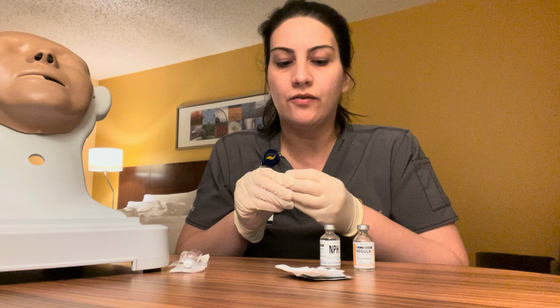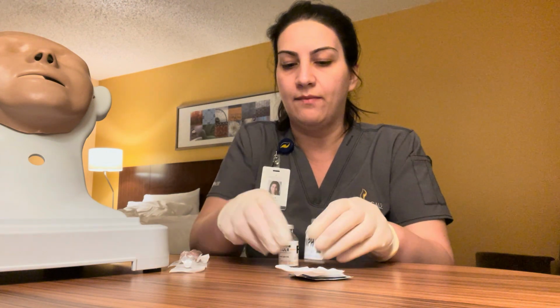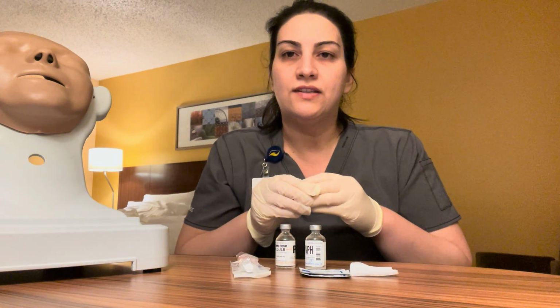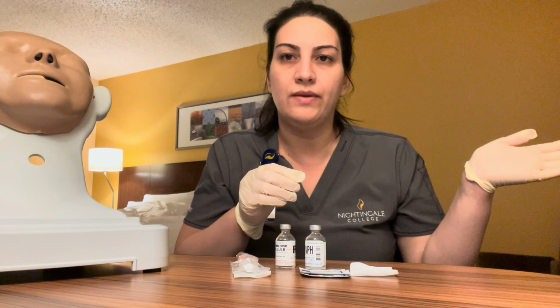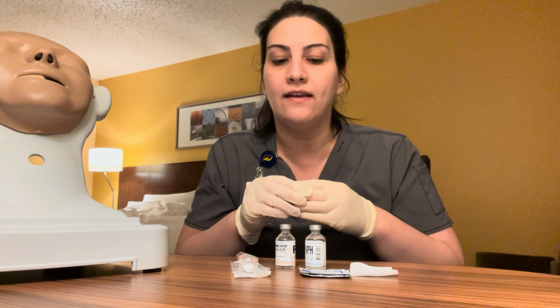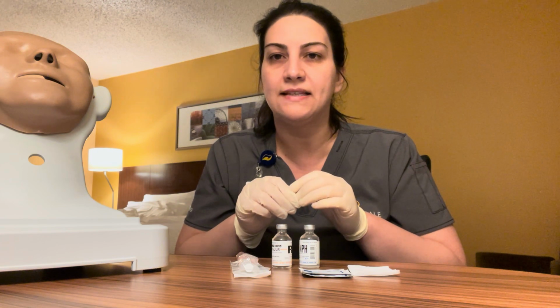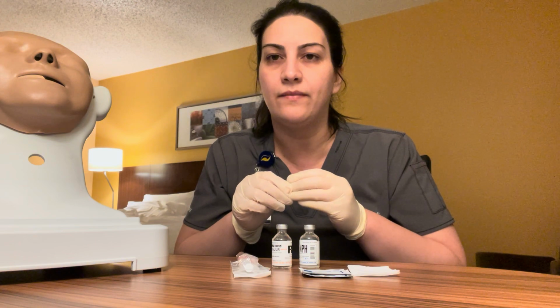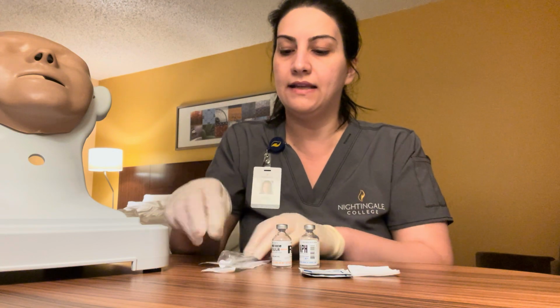So next we're going to be drawing up the insulin. We're going to start off with the NPH. Before I do so, I'm going to have a nurse here by me. She's going to be verifying the units individually, and then we're going to verify against the MAR all together, which is going to be equalizing to 12 units in total. So I'm going to get started here.